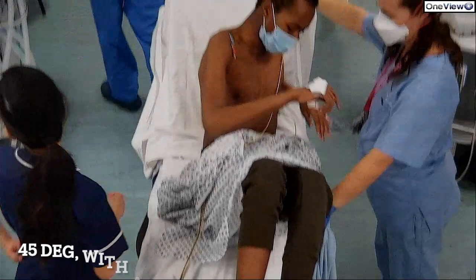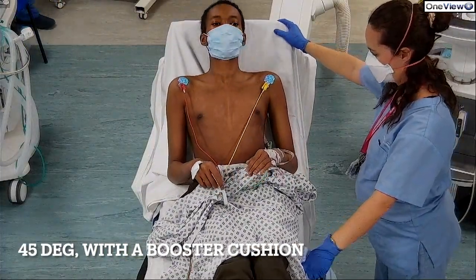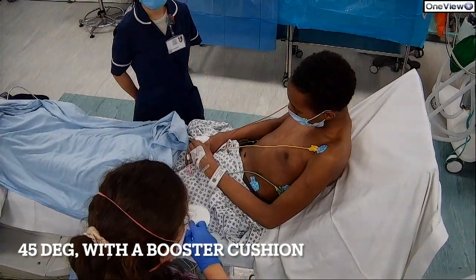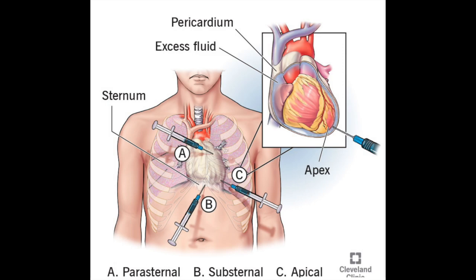Step number one is to get the patient positioned at 45 degrees with a bolster cushion in the cardiac catheter lab, and be ready with emergency equipment. This patient is being prepared — he's not in extremis, but the decision was made to put a drain in. Step two is to find out where you might drain it.